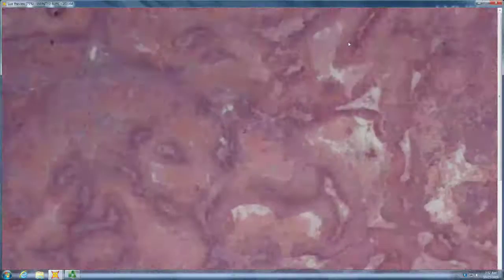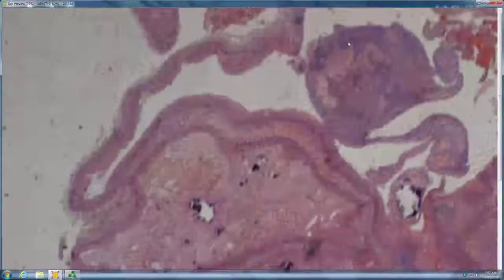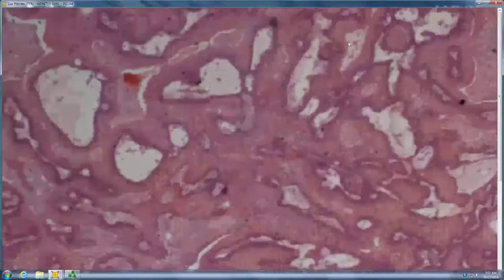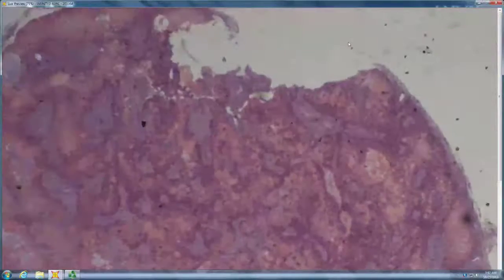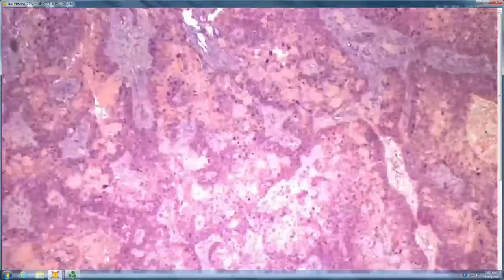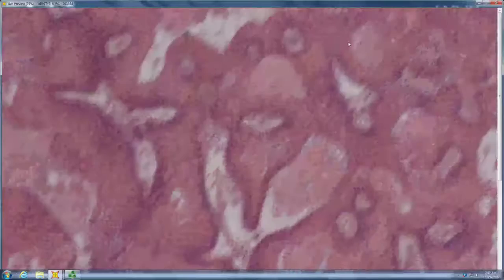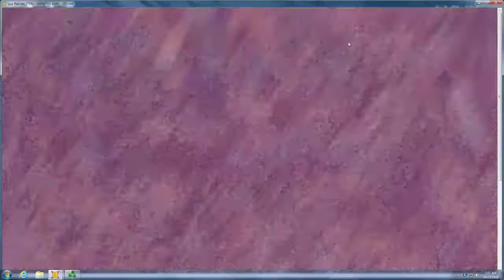Like a proliferating pilar cyst, except that this one maybe metastasized. So what's the difference between proliferating pilar cyst and malignant proliferating pilar tumor that metastasizes? Atypia, right? So unfair that I only showed you the bland portions of the proliferating pilar cyst. There are portions that are anything but bland in this tumor. If there's an infiltrative border or high-grade atypia within a proliferating pilar cyst, it's no longer benign and is capable of metastasis.